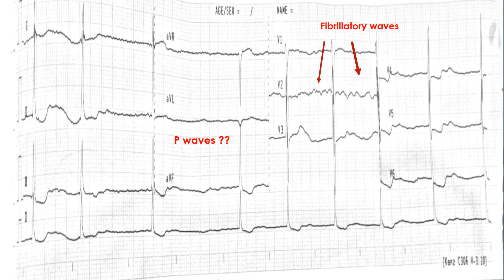What we see instead are chaotic waves. These are the fibrillatory waves of atrial fibrillation. This confirms the rhythm — this patient is having atrial fibrillation. Because of that, there are no P waves; instead, there are fibrillatory waves, and he is having an irregularly irregular rhythm. Always try to see the P waves first, and if you cannot see them, then look for other evidence such as fibrillatory waves, as in this case.